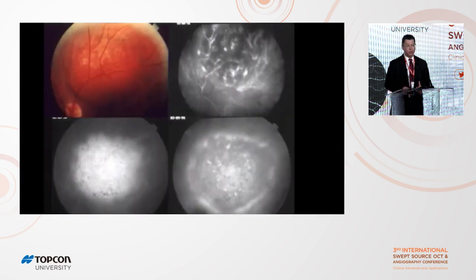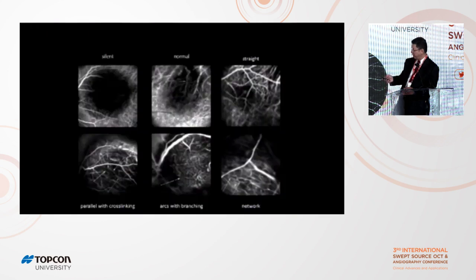similar to what we got with ICG angiography, where we could differentiate benign tumors like this circumscribed choroidal hemangioma with typical features of hypercyanescence and washout of dye in the late phases of the ICG angiogram, and also the different patterns of vascularity of melanoma can probably predict in different studies.